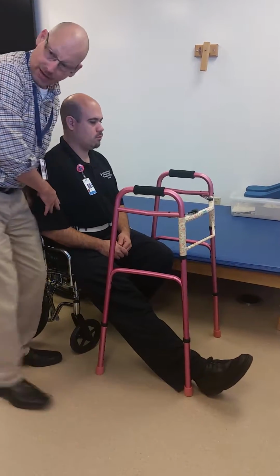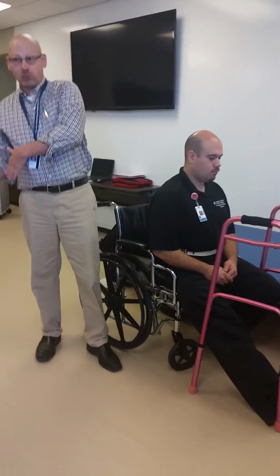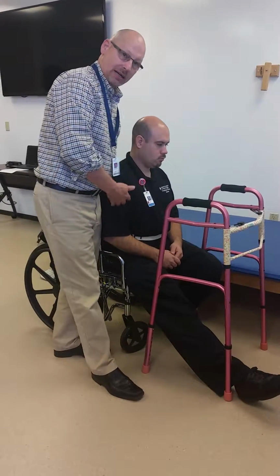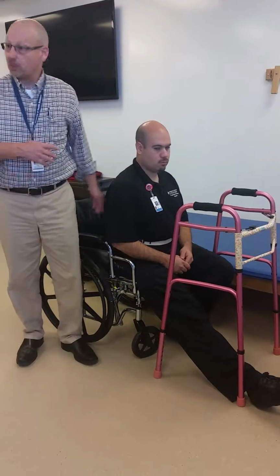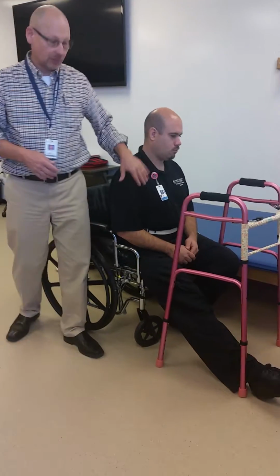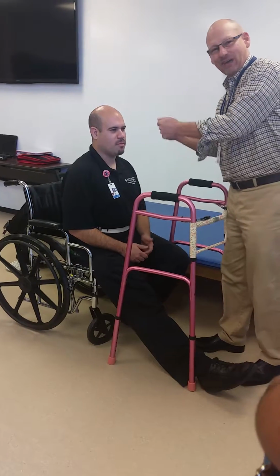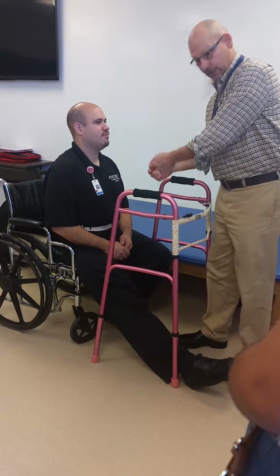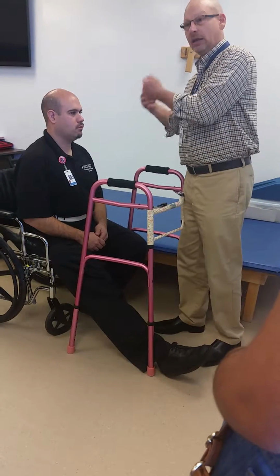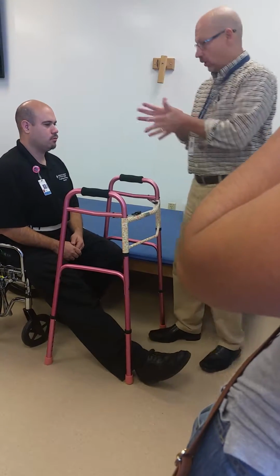And then I'm on his weak side, right? Because if a patient's going to fall, they're probably, not always, but they're probably going to fall towards this side. Plus, if he fell that way, the mat's there to catch it. So I can stand over here and help him. For you guys, it's probably best to do it this way, especially as new grads, new students. Get out in the clinic. Randy's a big fella. So even if I was in the clinic and met Randy for the first time, I would probably ask somebody to stand by for me. Because truth be told, if Randy were suddenly to lose his balance, I couldn't stop him as well as two people could. So always know your limitations.